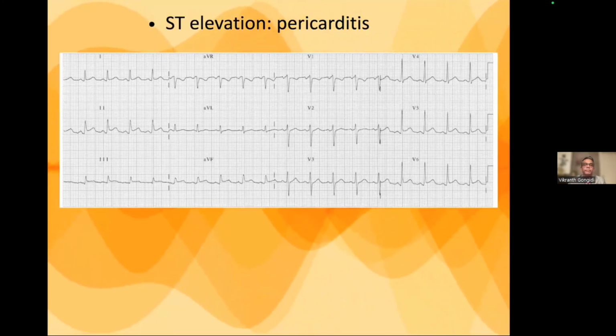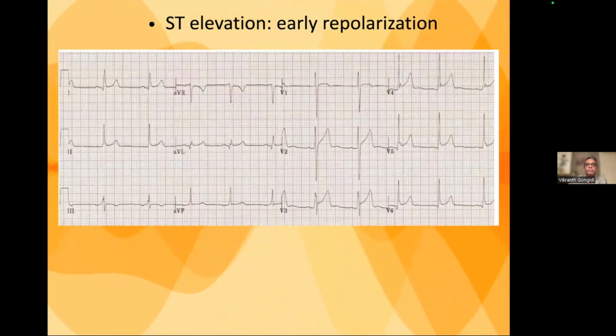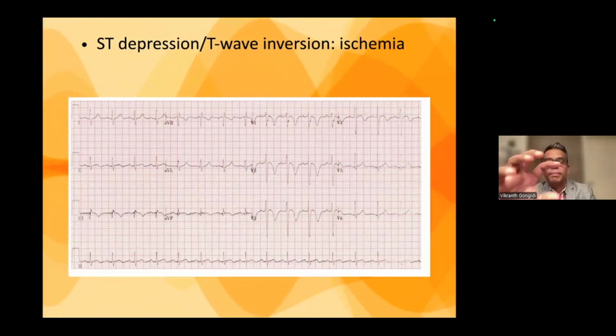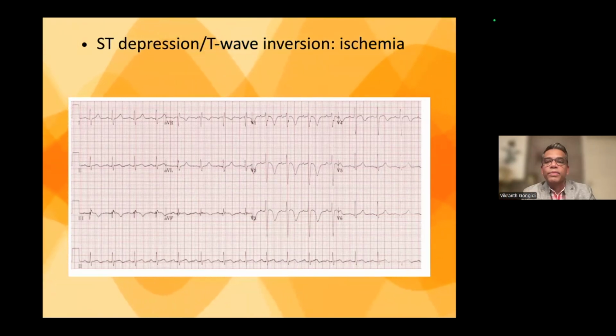What do you look for when identifying repolarization changes, such as in hypertrophic cardiomyopathy? So typically they're not as symmetric, and you'll see them in multiple leads. If it's an ischemic related issue, it would usually be in a coronary distribution. So in this situation, it's mostly V2, V3, and V4. Whereas if it's hypertrophic, it would be pretty much in all the leads.